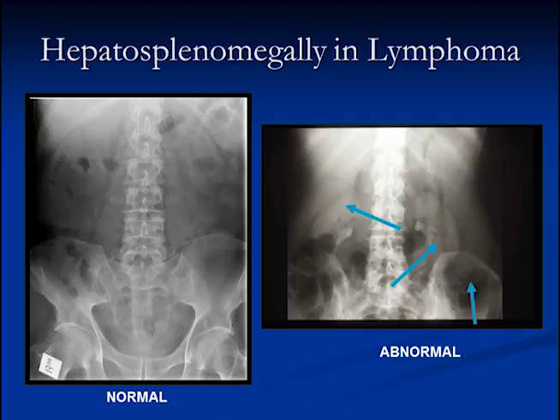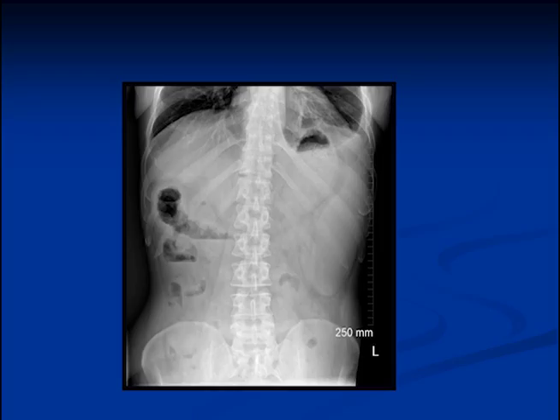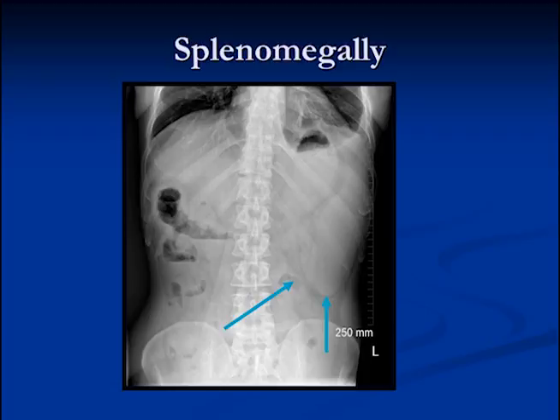Here's the edge of the liver. You can clearly see the kidneys below this because there's contrast media in the collecting systems. Here's another young man who came in very sick, weak, and unable to move around very well. Looking at the plain film of the abdomen, we can see that there is an enlarged spleen going down towards the iliac crest. This patient actually had mononucleosis, which can sometimes cause splenomegaly.